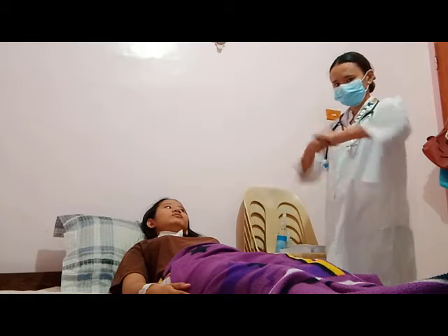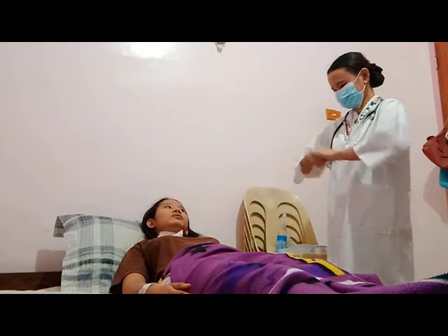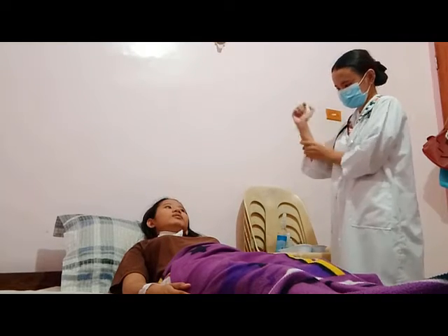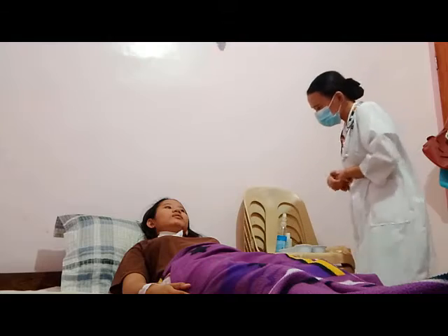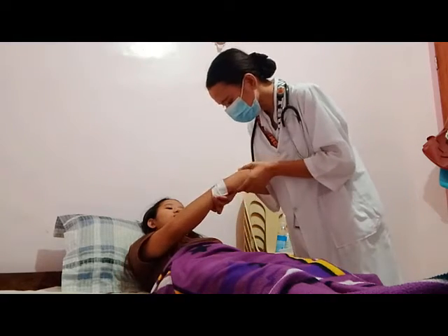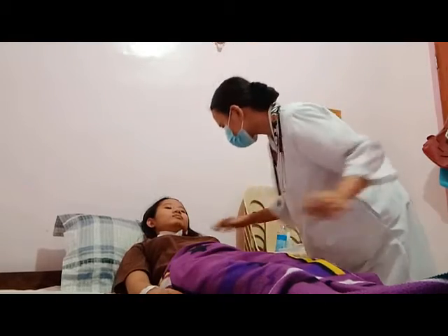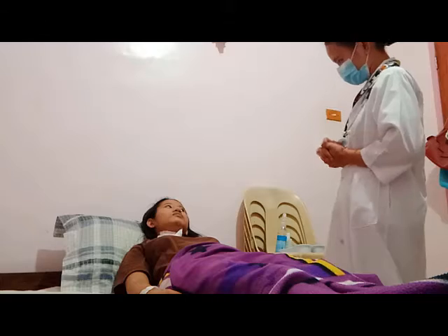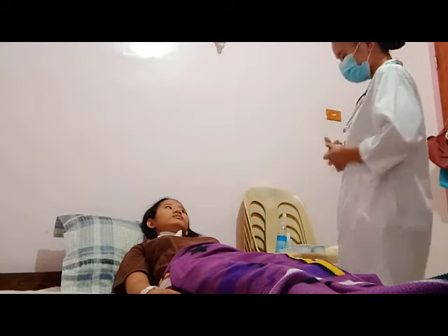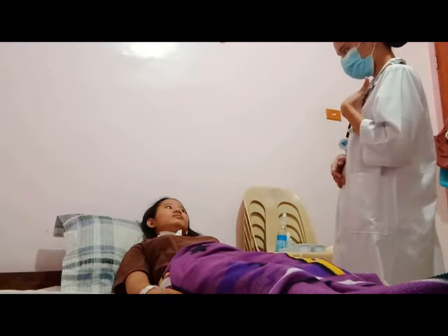Perform hand hygiene and put on PPE if indicated. Identify the patient. Close curtains around the bed and close the door to the room if possible. Determine the need for tracheostomy care. Explain what you are going to do and the reason to the patient, even if the patient does not appear to be alert.